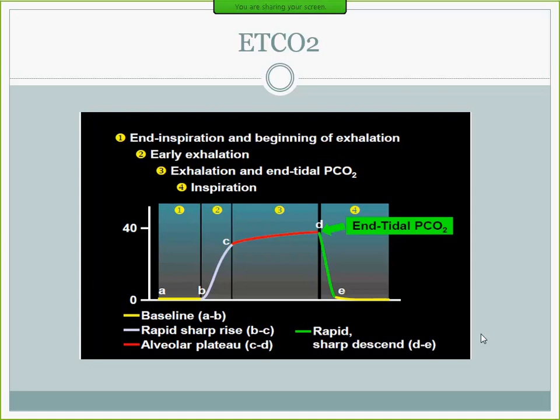So you know the patient's CO2. When you do a blood gas, it is just the CO2 at a particular point in time, whereas this is continuous. If you have something that gives you a continuous number, you can't ask for anything better, right? So that's one of the monitoring devices we should be using: end-tidal CO2, which will tell you the actual alveolar ventilation that is going on.